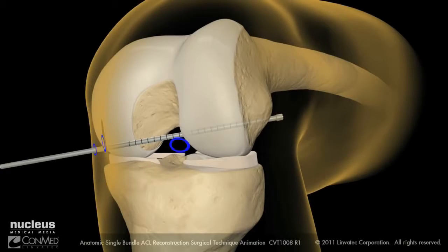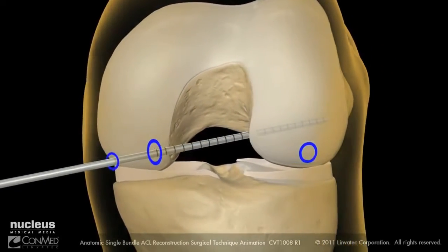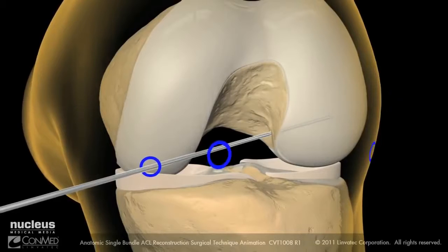Using the XO button drill bit as you would use a standard depth gauge, manually pull back on the bit to hook the head of the drill bit on the external femoral cortex to confirm the aperture to cortex length. Remove the XO button drill bit, leaving the graft passing guide pin in place.